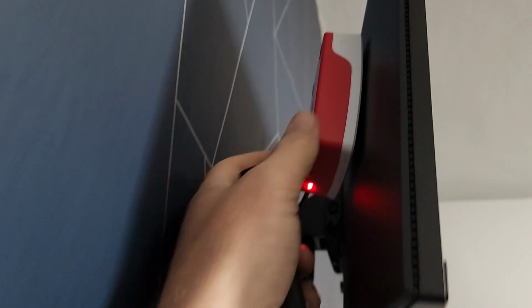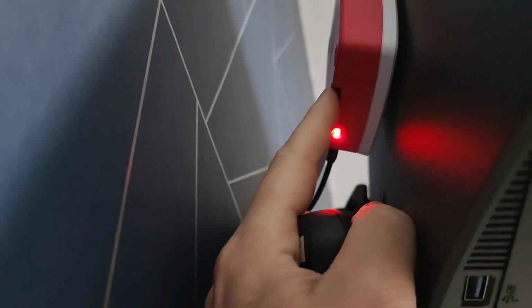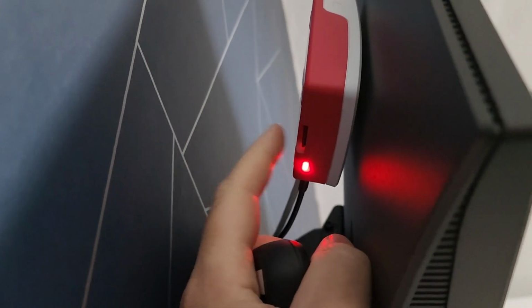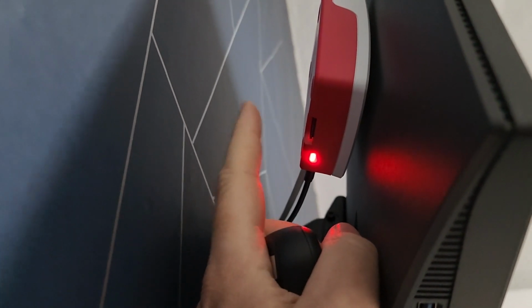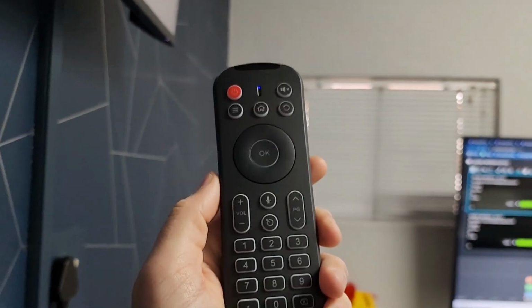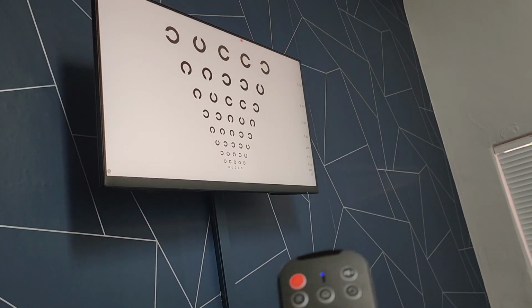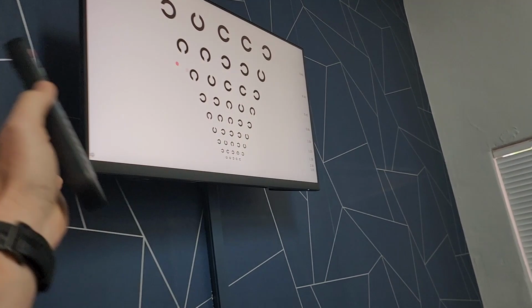This is called a Raspberry Pi. It's a really cheap little computer. And in here is a little SD card. And so I've adapted some software from Openoptometry online, which runs off this SD card. So you just plug the SD card in, and you plug it into your monitor. And then there's a USB that plugs in from this, and it connects to here, and then you've got a VA chart. So it's a really cheap solution, 600 Rand, plus your monitor.